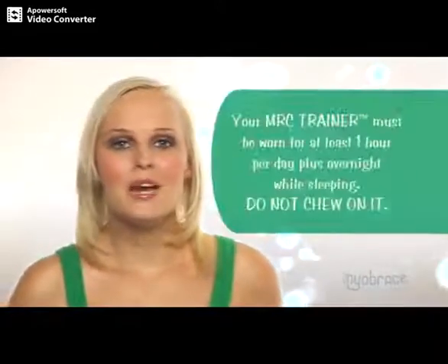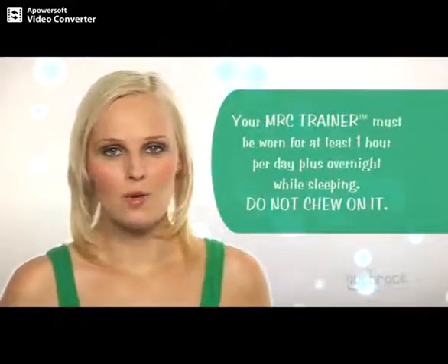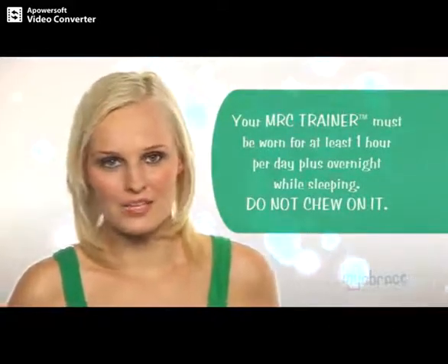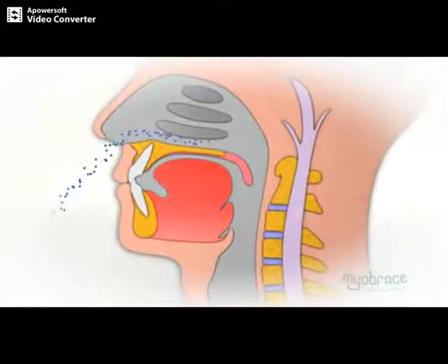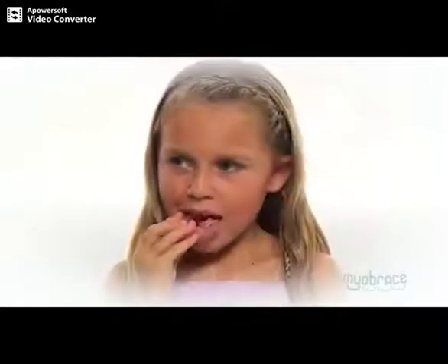The MRC trainer must be worn daily for at least one hour per day plus overnight while sleeping. While the MRC trainer is the most important part of your treatment, it cannot do everything. It is important that we assist the use of the MRC trainer by doing certain tongue, mouth and breathing activities. These activities should be performed daily along with wearing your MRC trainer.